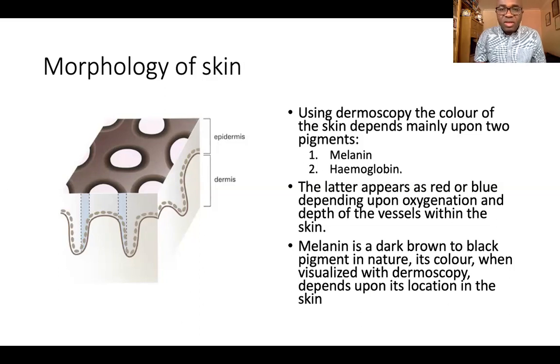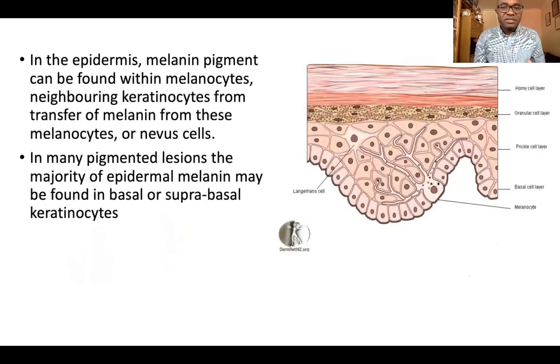One of the feedbacks I got from the live lesson was, how would dermoscopy look on pigmented skin? We all have the same amount of melanocytes, whether it's skin type 1 or skin type 6.